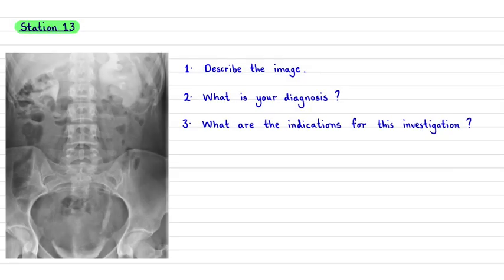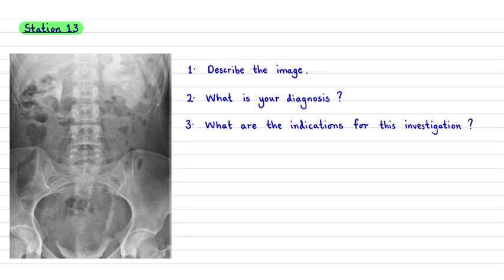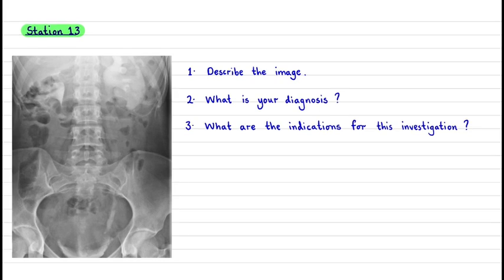So what I was saying is, whenever you have unexplained gross hematuria, you can order an intravenous pyelogram to rule out the structural causes of hematuria. Same case for suspected renal masses or tumors, as well as evaluation of the general anatomy, as well as the physiology, which is the filtration ability of the kidneys.